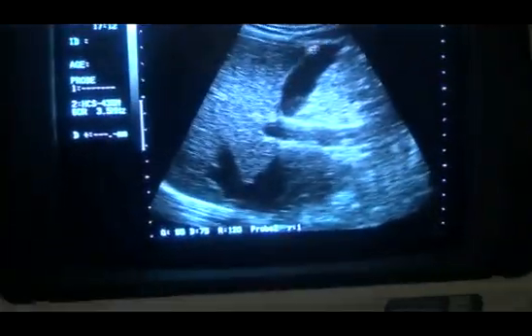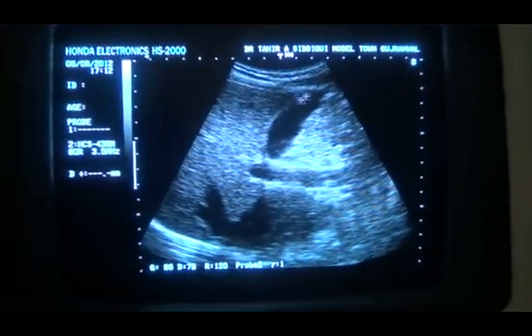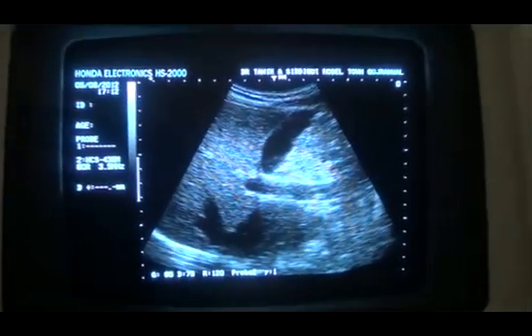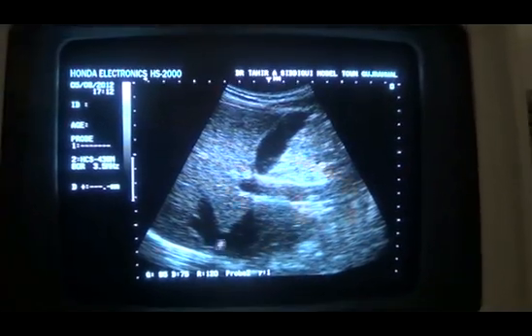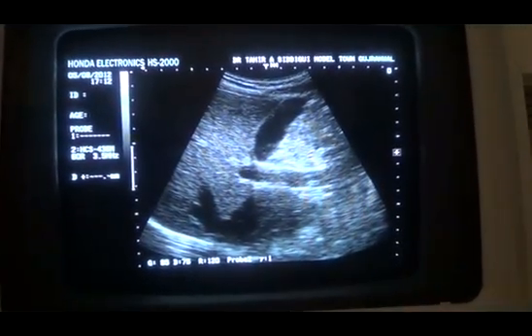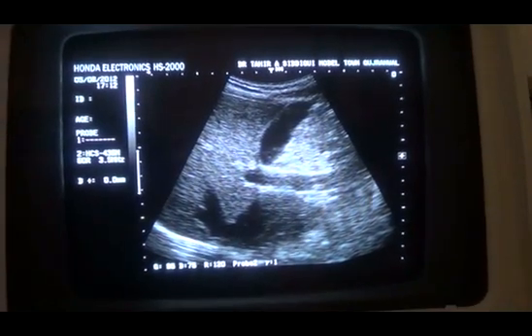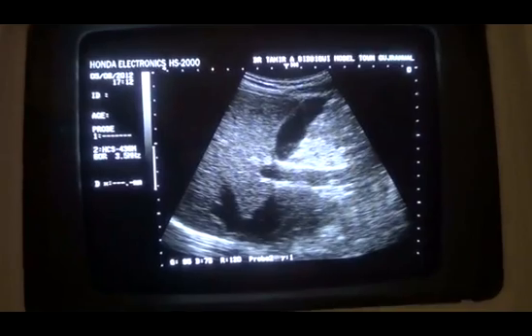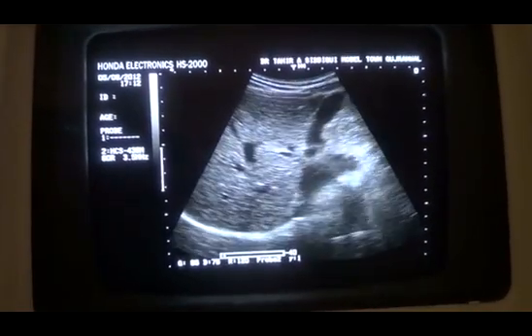And here we are. On the ultrasound, in this view I can get the gallbladder with the fundus, with the portal vein, and with the hepatic vein. This is another way of seeing the gallbladder.